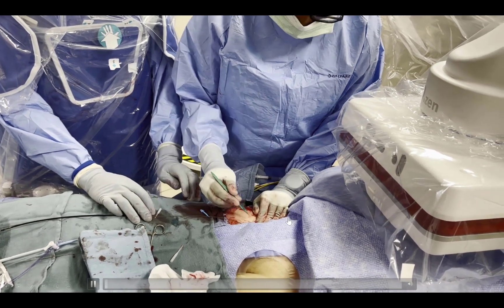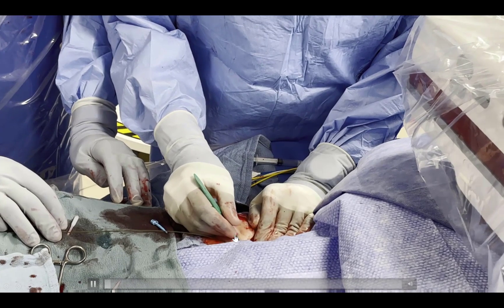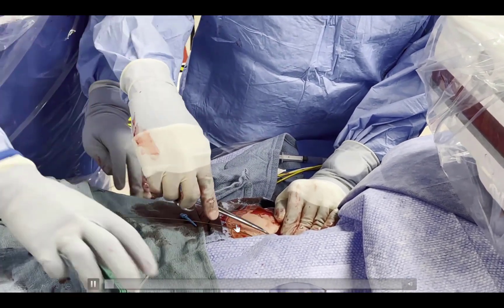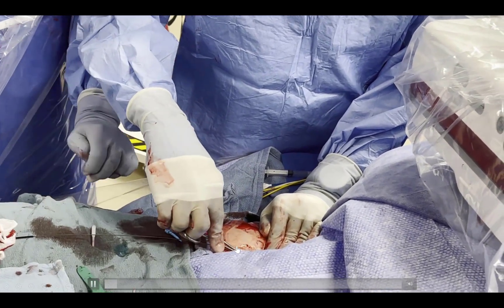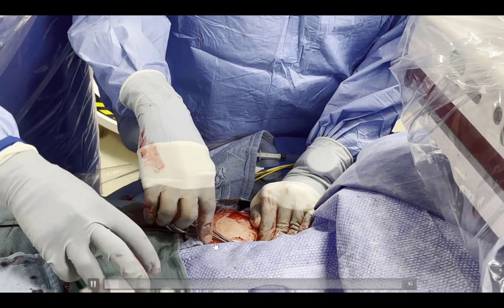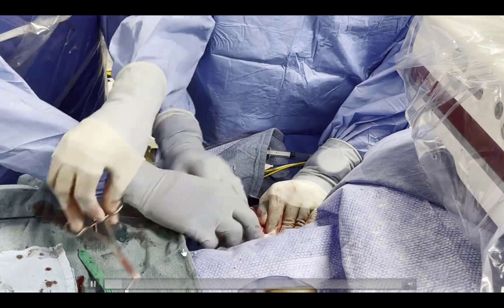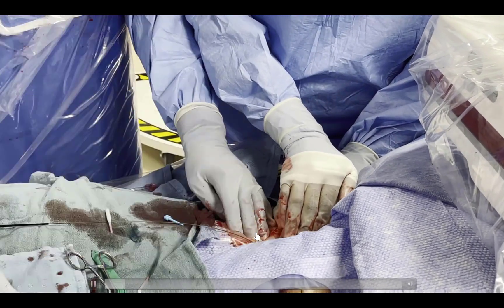This is a video showing how the steps are performed. We have obtained access and performed angiography showing the artery is of good caliber. Now we are dilating the track all the way to the arteriotomy, first with a scalpel and then with a hemostat. This ensures the sutures will reach all the way to the arteriotomy to help achieve hemostasis.